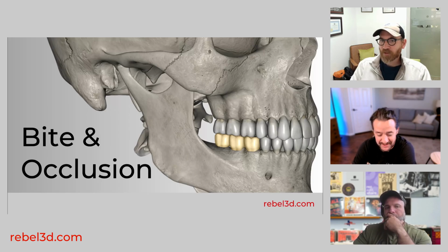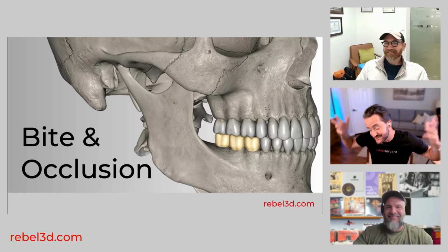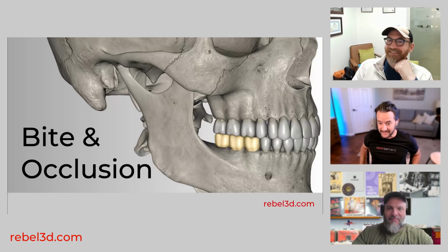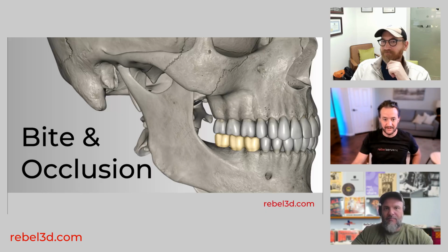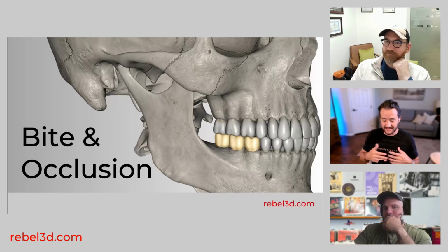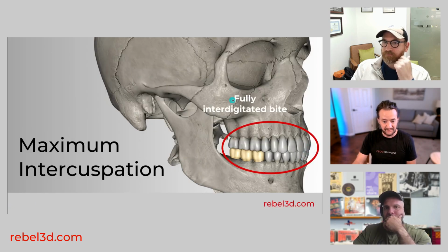Dr. Sven, you said a few minutes ago that sometimes it can be like a religion and a dogma. And if it's religious, you're right and everyone else is wrong. But there are some fundamentals, some definitions and some common anchor points in how we approach the bite and occlusion. I wanted to spend a few minutes establishing some definitions, and then we'll jump into a case and talk about how you manage occlusion, how Daniel is able to manage occlusion. So thanks, guys, for being here.